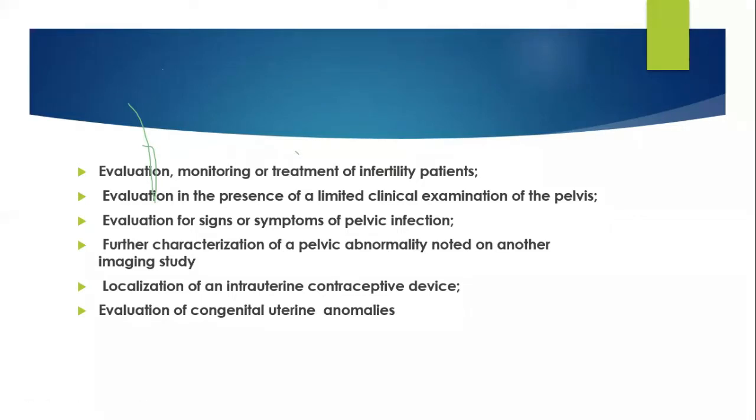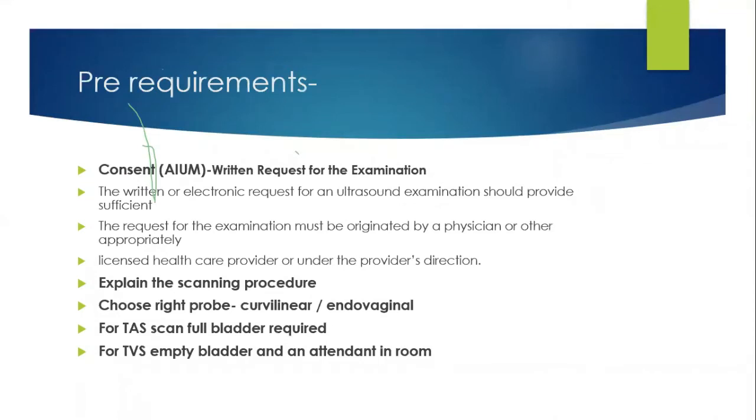So these are the indications which we all are familiar with. But since today's class is more on ultrasound, we are going to discuss more on that. Now, what are the pre-requirements? What should we do before we begin with an ultrasound? We should try to explain the procedure to the patient.